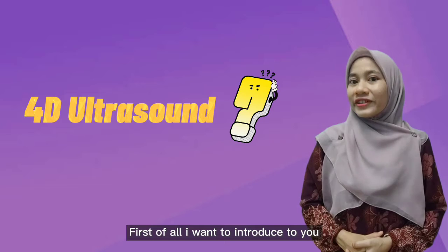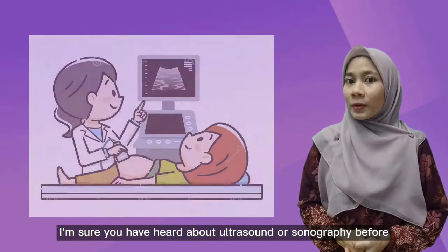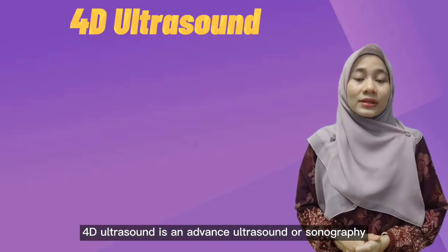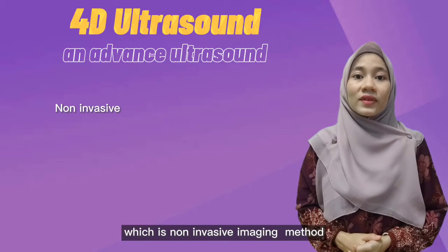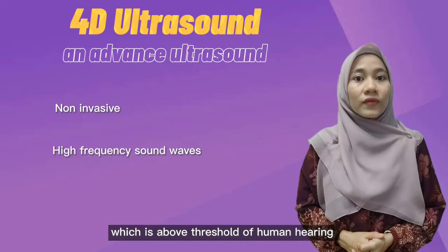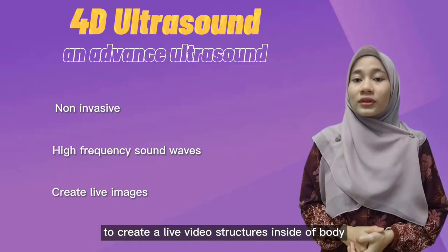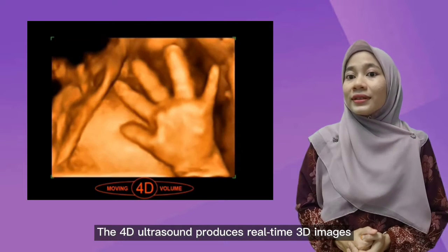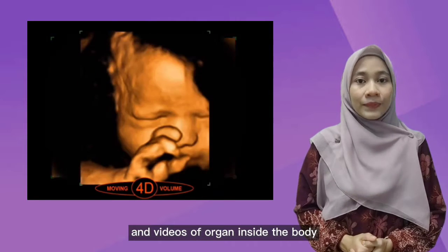First of all, I want to introduce to you what 4D ultrasound is. I'm sure you have heard about ultrasound or sonography before. 4D ultrasound is an advanced ultrasound or sonography, which is a non-invasive imaging method that uses high frequency sound waves, which are above the threshold of human hearing, to create a live video of structures inside the body. The 4D ultrasound produces real-time 3D images and videos of organs inside the body.